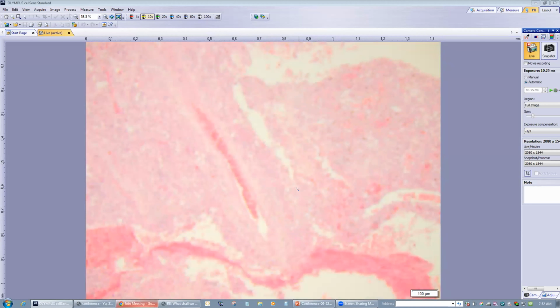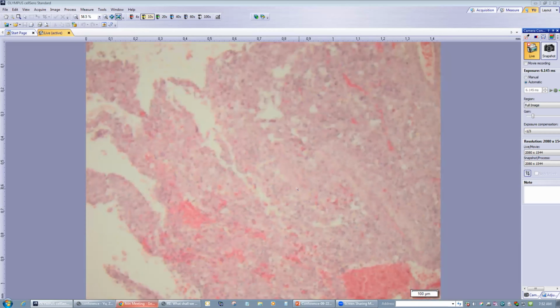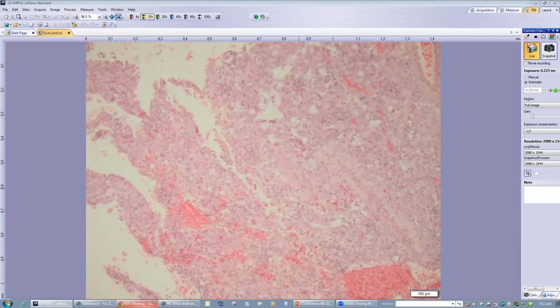So that's the thing. The clinical hint is multiple facial angiofibromas. That is a feature that suggests tuberous sclerosis. This tumor, which we call AML, angiomyolipoma, is in the majority also associated with tuberous sclerosis.